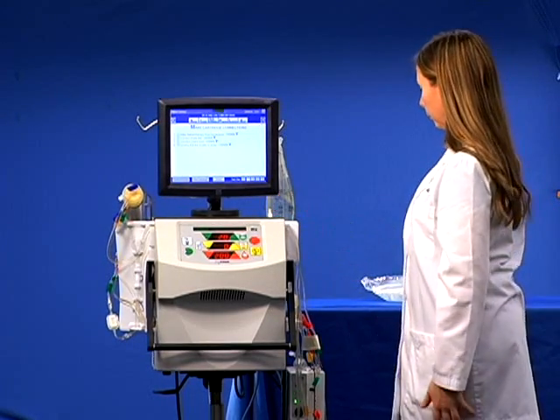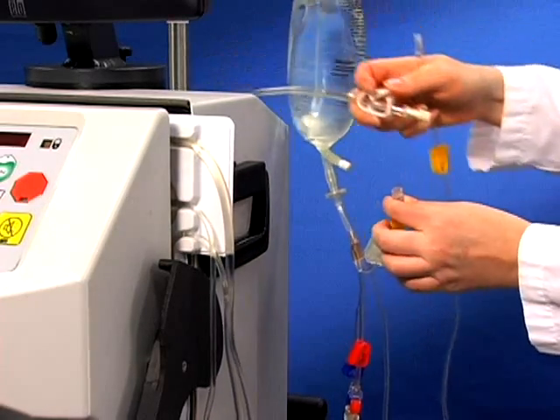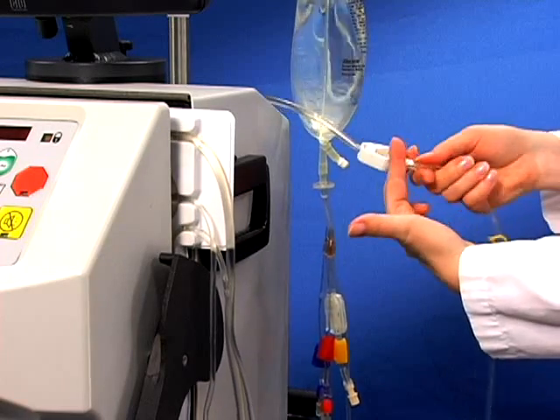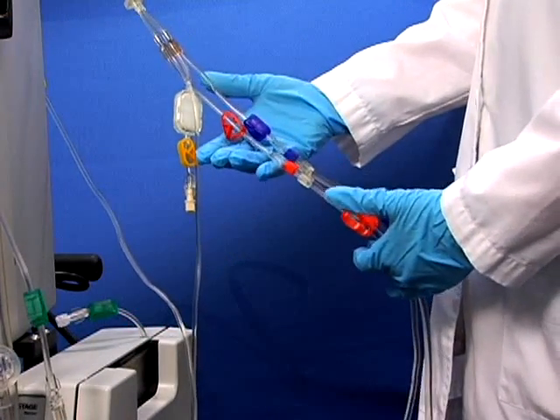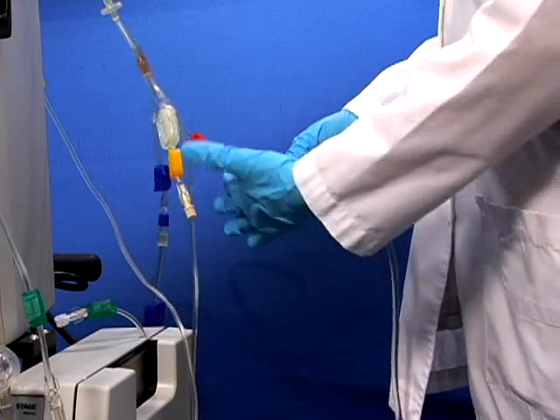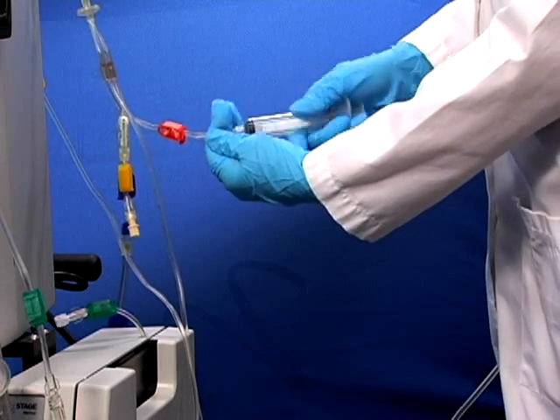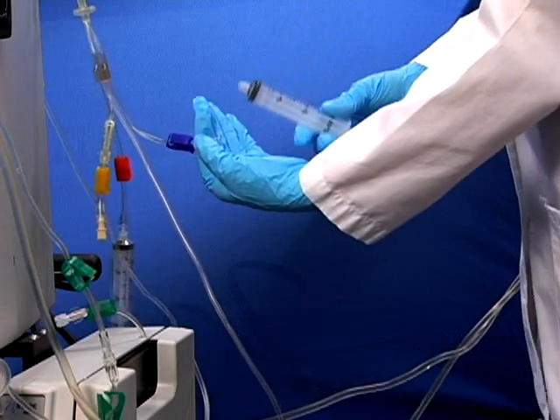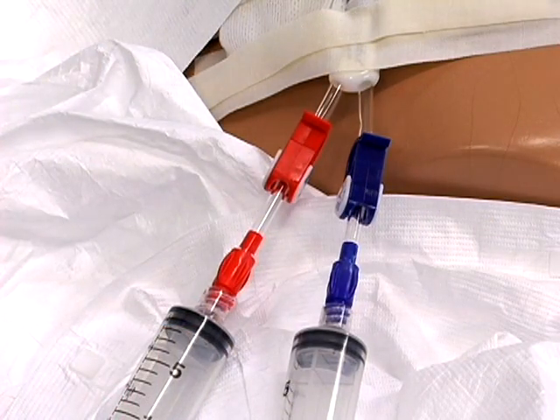Go back to the priming spike and find your yellow waste line. Clamp and disconnect this line and connect it to the waste line extension. Unclamp both. Locate the patient lines at the priming spike. Clamp and disconnect. Connect patient lines to the patient's vascular access and unclamp all clamps.